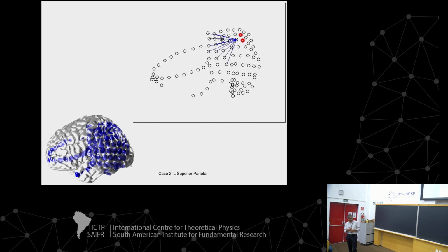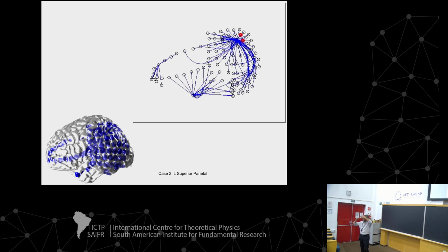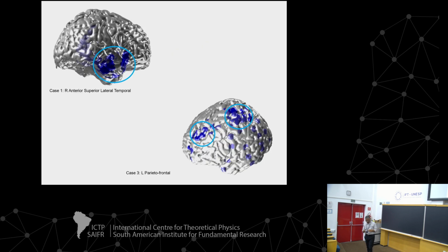This is a second patient with left superior parietal onset of seizures. The two contacts here are the seizure onset contacts. It doesn't go to the seizure onset contact, but the rim is like 1 centimeter or a couple centimeters away, so it goes close to it. It goes to proximity of the seizure onset area. It doesn't just go there. There are other areas that are further away that the algorithm also goes to, like in the frontal lobe. But at least where the seizure onset area is and large parts of cortex around it seem to have this gradient, which is interesting.